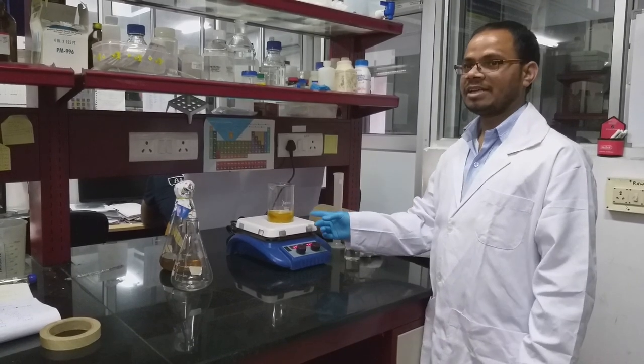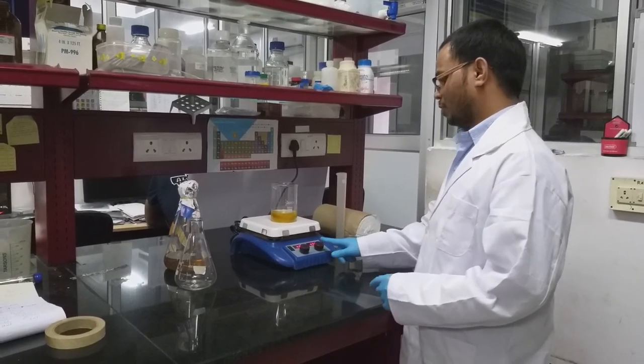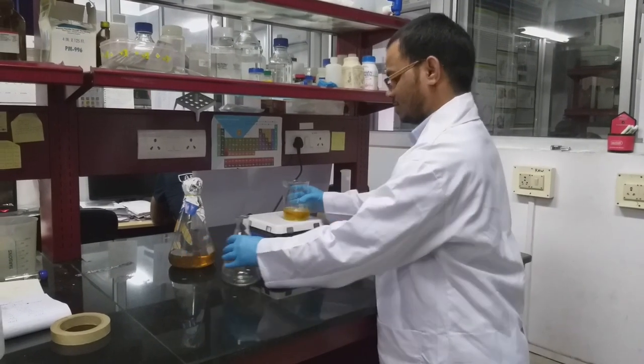Now the media components are completely dissolved. Now we have to pour into the flask.